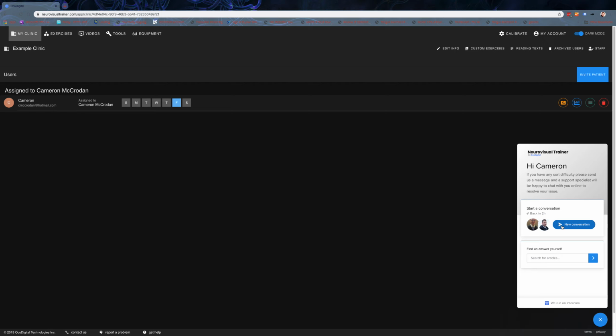This is sort of one of those platforms that the more of us who use it, and the better that we make it, the better it's going to wind up being for everybody. So for example, in the videos, you'll notice some of those videos have been given in by my clinic. Some of them were given in by Paul's clinic, for use within the platform. And I know hopefully one of the future things that's going to be there is the ability for people to share videos and activities with each other.